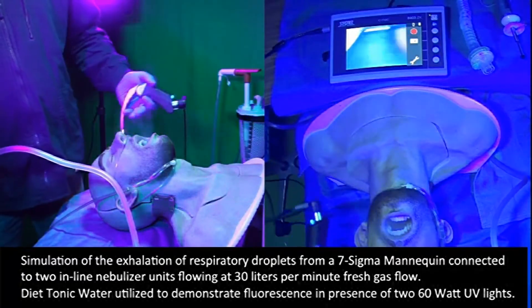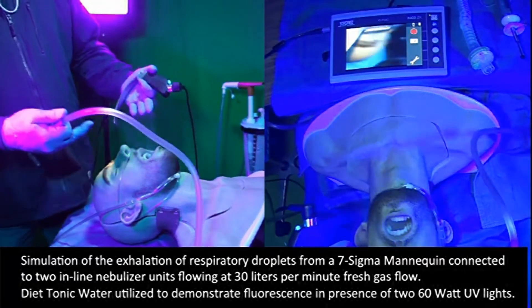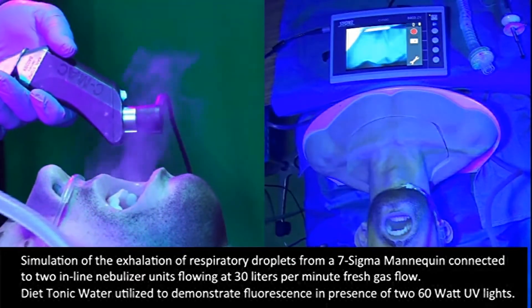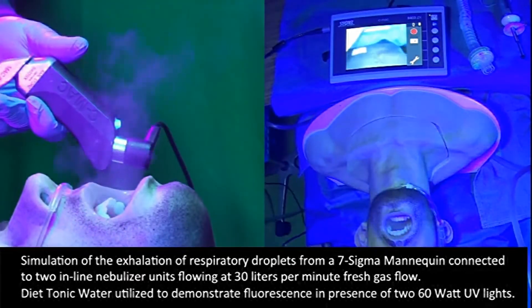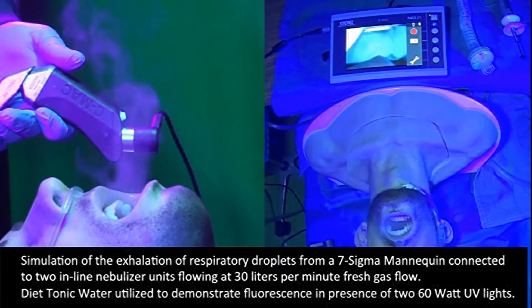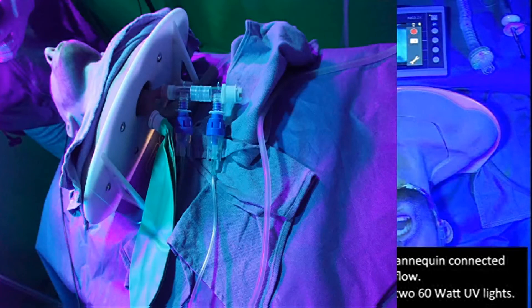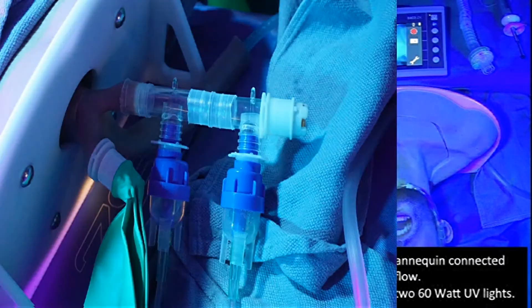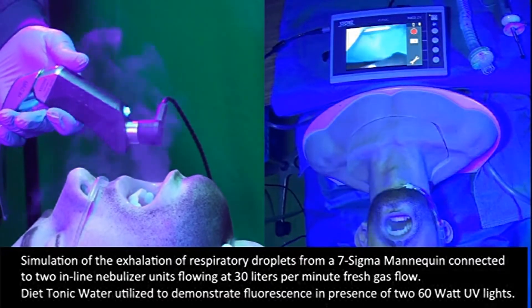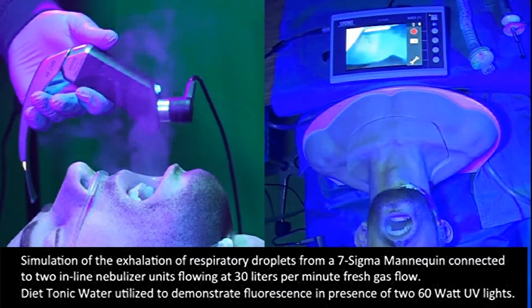We are demonstrating a simulation of the exhalation of respiratory droplets from a Seven Sigma mannequin connected to two nebulizer units flowing at 30 liters per minute. We are seeking to investigate in a simulation setting simple and effective techniques to reduce airborne contamination of a clinical workspace using handheld suction and the elements of the SALAD technique.